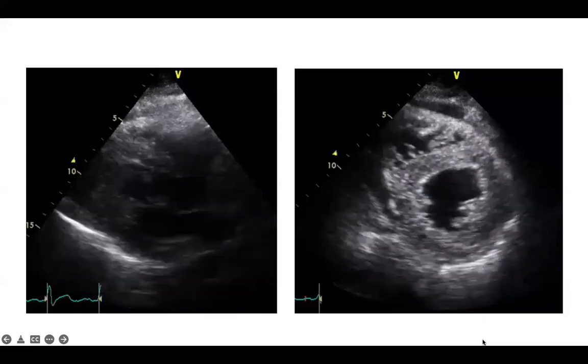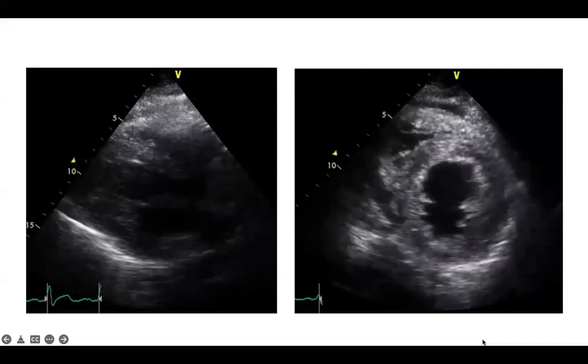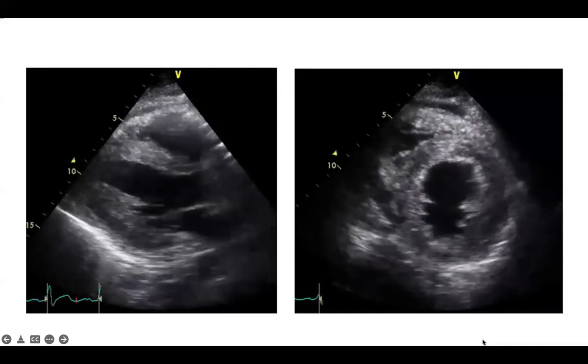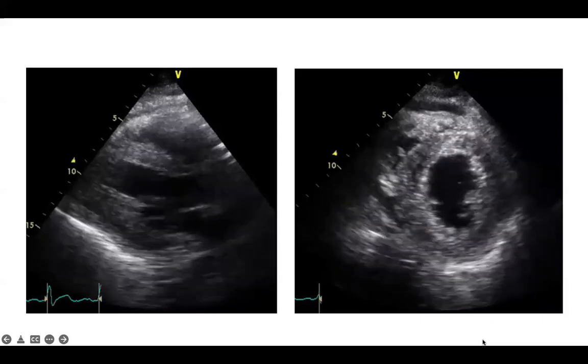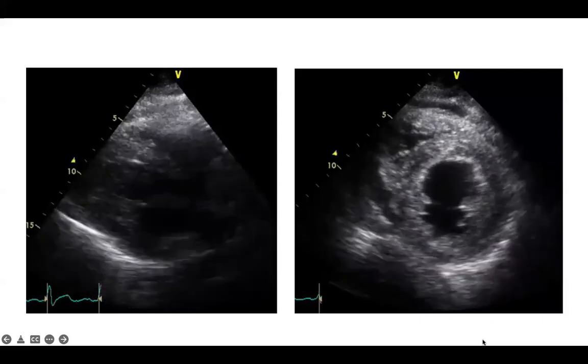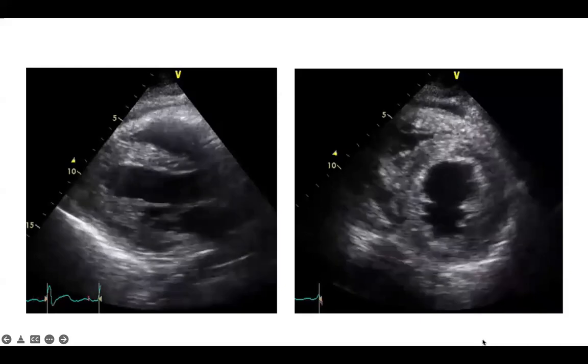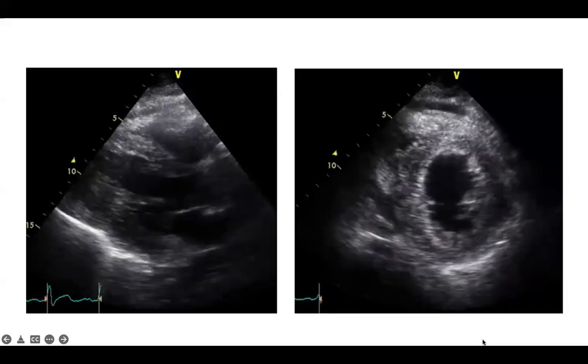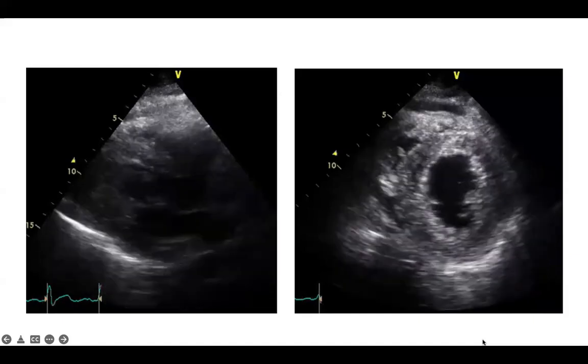And this patient with hyperdynamic heart and high ejection fraction and cardiogenic shock can be a patient with acute severe mitral regurgitation, for example, due to ruptured papillary muscle, flail mitral leaflet. With these patients, you will see very low afterload. You will see hyperdynamic heart, but ejection fraction in this patient will not indicate systolic function, لأن blood رجع retrograde instead of blood going forward across the LVOT.